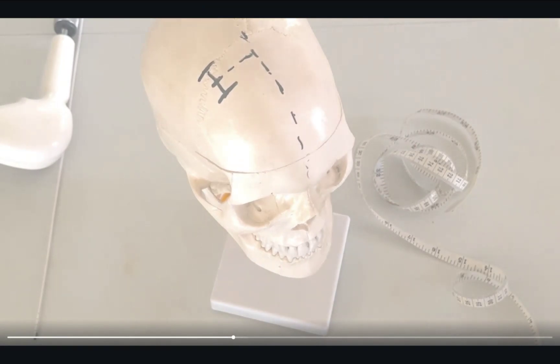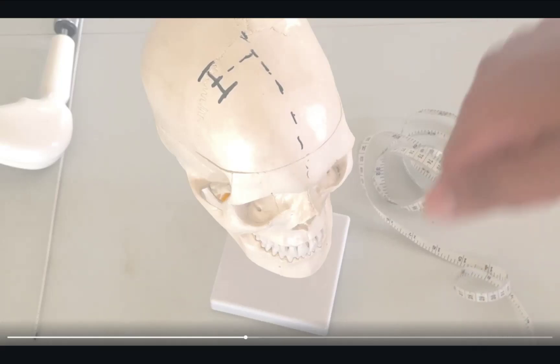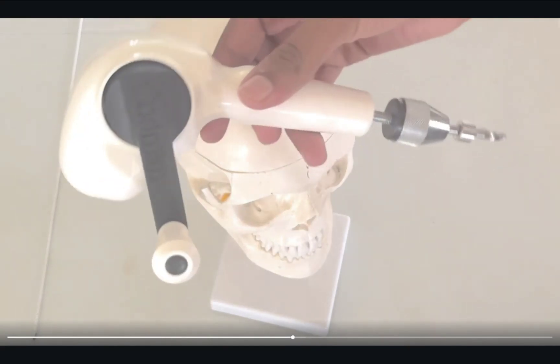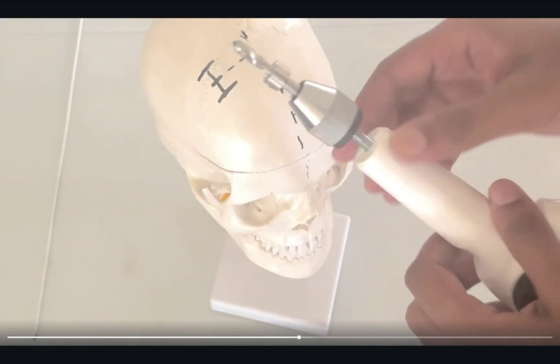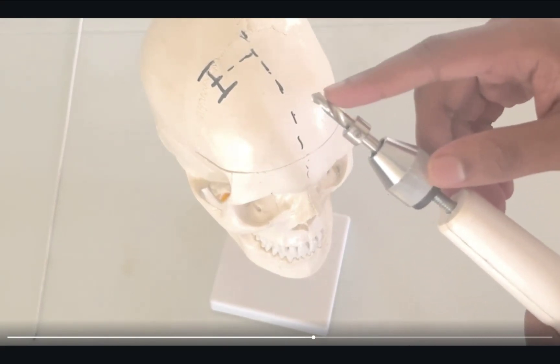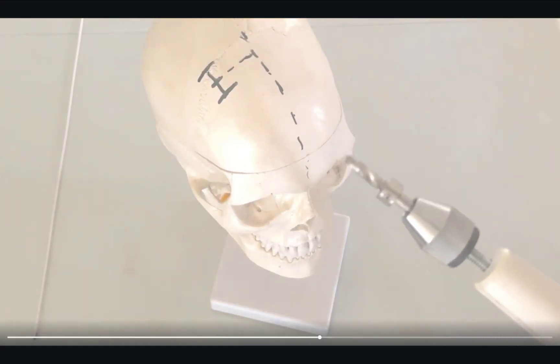Next step is you'd go through the skin, the muscles, and reach the bone. You'd use a periosteal elevator to get the periosteum off the bone, then you'd use a drill. In most situations you have an electric drill in a theater situation. However, there might be certain circumstances in a ward or ICU where you might need to use a handheld drill. This is a Codman's handheld drill. You can use an adjuster to adjust the depth, and that prevents you from penetrating past the bone and into the brain. You can identify how deep it is based on the scans as well.